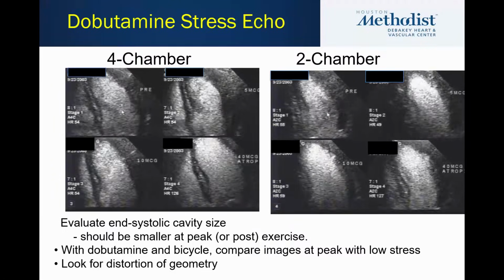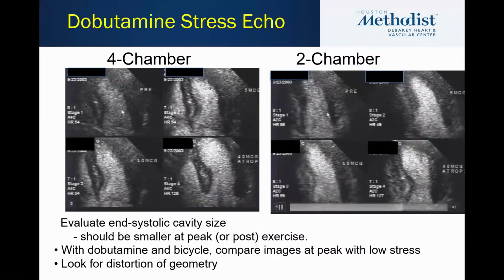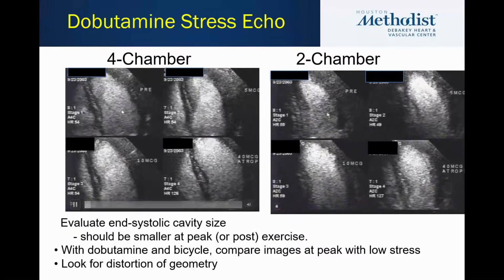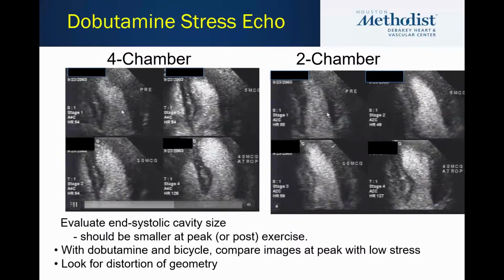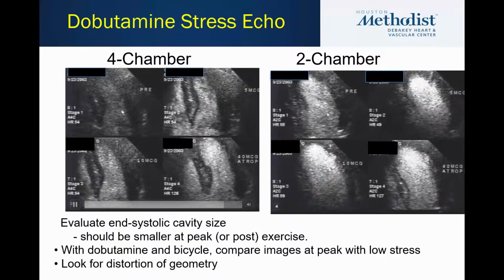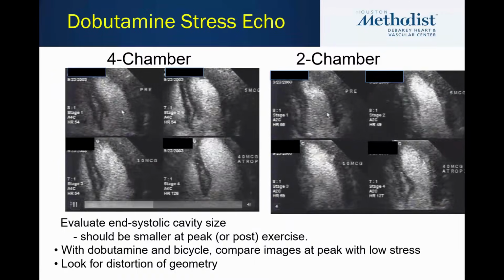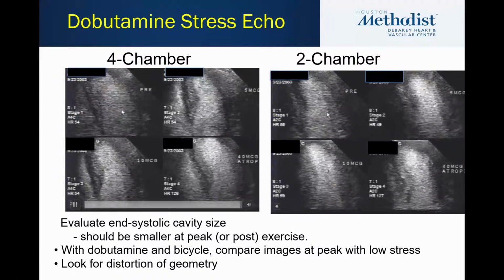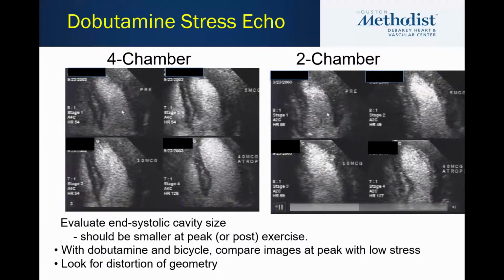You know, LAD lesions are always easier than the others because it involves a larger territory and you have the apex involved. And again, the same story. Now you see the end-systolic area here compared to here where clearly it is dilated. And in fact, the whole cavity is dilated at end systole, which means a drop in ejection fraction. So these LADs are always a little bit easier.